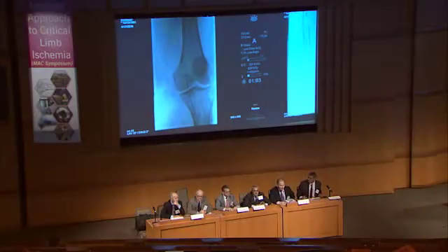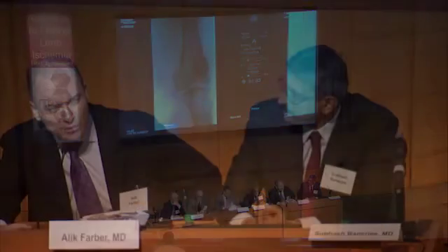So the profunda angiogram did suggest to me that most of it is coming from the profunda venous communication. Anyone else? And Alec, what's your interpretation? Well, there's no question that we need to, at some point, evaluate the extent of this AVM. This is a symptomatic leg, and from what I understand, there's also edema present. So at some point, you're going to be treating that AVM. And yes, the more information you have before you do that, the better.